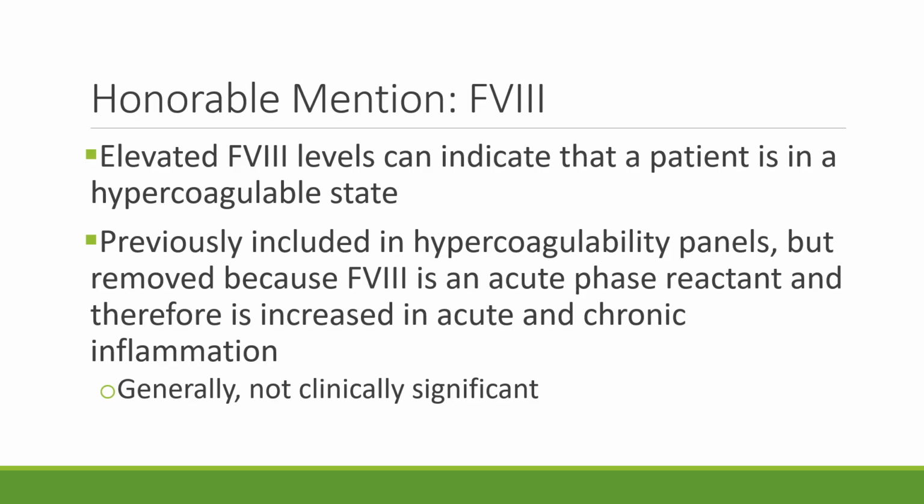Just a couple more tests to go, but we have an honorable mention, factor 8. Elevated factor 8 levels can indicate that a patient is in a hypercoagulable state. However, because it is an acute phase reactant and therefore is increased in acute and chronic inflammation, we no longer utilize it as part of our hypercoagulability panel.